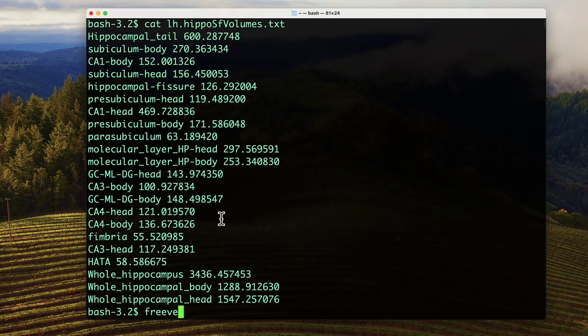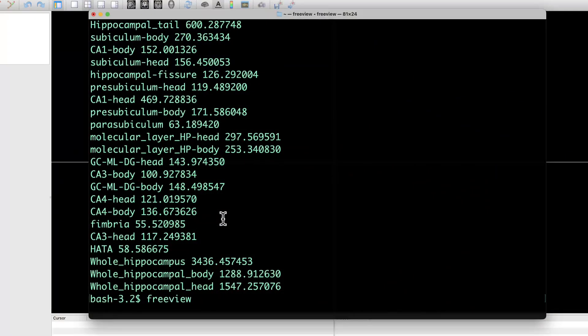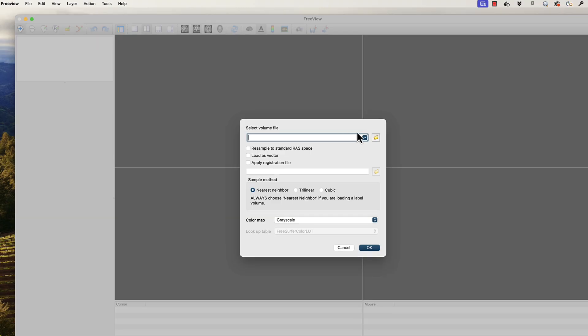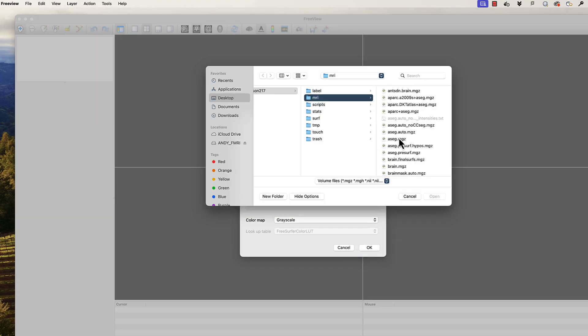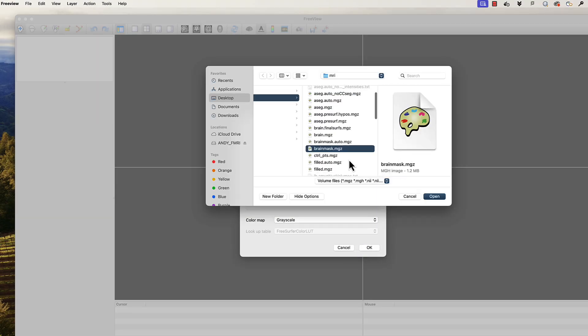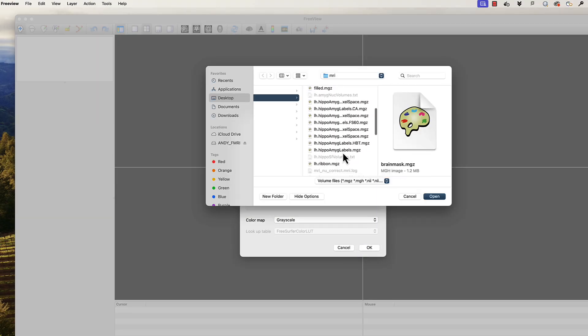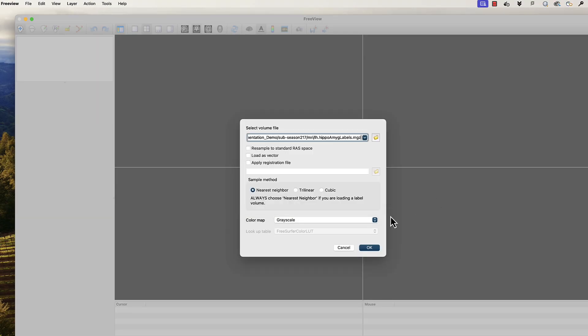The segmentations can then be visualized in FreeView by loading them as volumes with the file brainmask as an underlay.